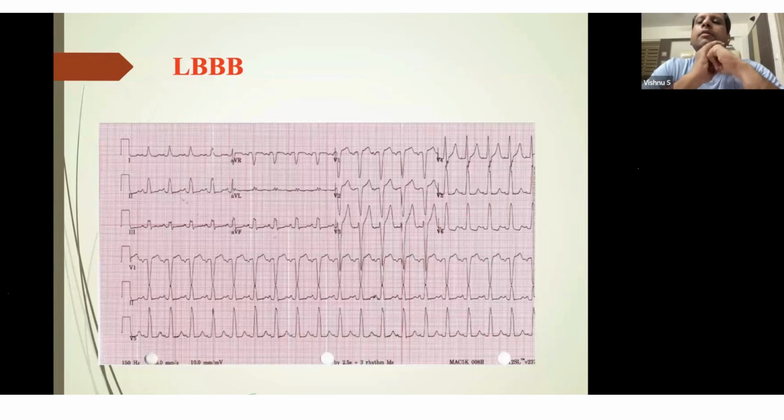In that case, in the clinical context of absence of chest pain, if there is an increase in heart rate with LBB, and that LBB settles down when the heart rate goes down, when he rests with a tranquilizer or something, or if he sleeps and the ECG settles down, that is a rate-related left bundle branch block.